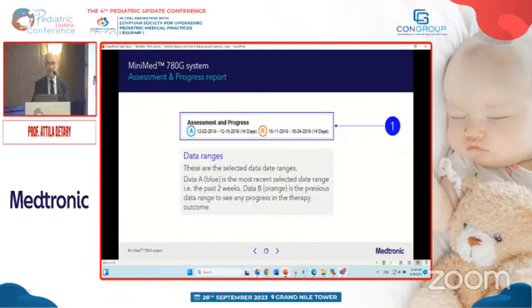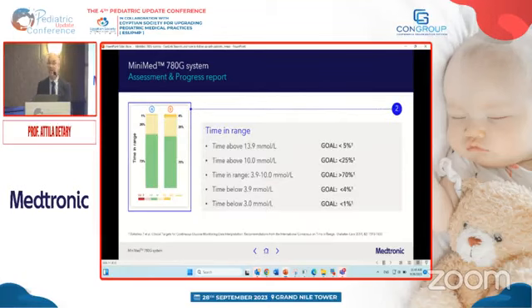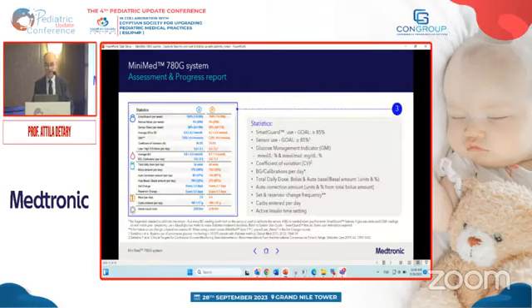So this is the time period you select, then the time in range. That's the consensus statement. What is the expectation in the green area, more than 70%? Then you have the above, the below. So this is what you should keep in mind. And then you have a lot of statistical information related to the sensor.